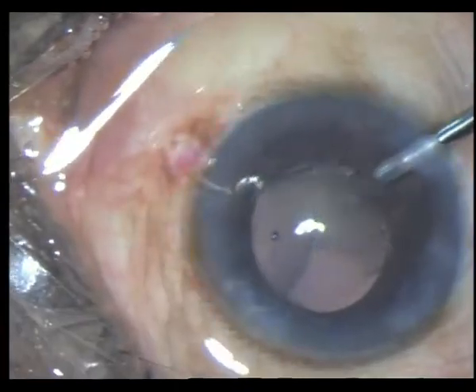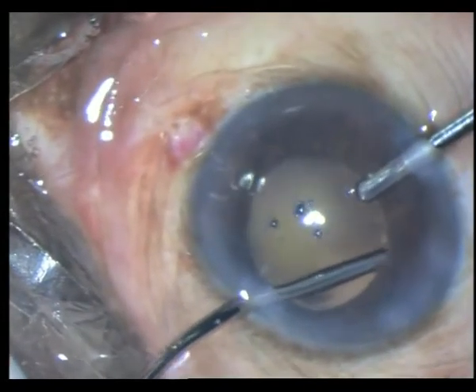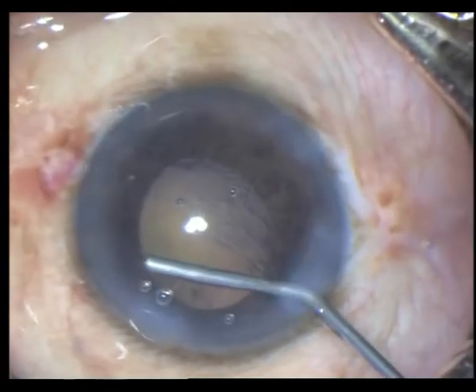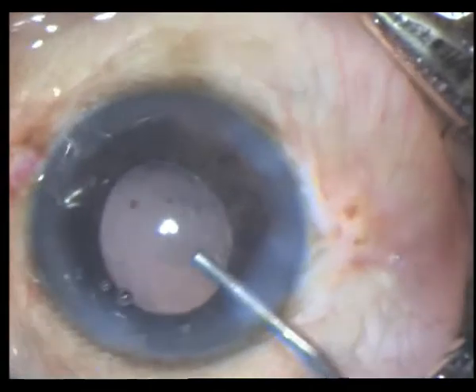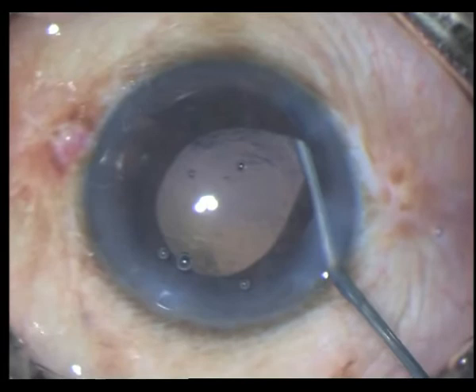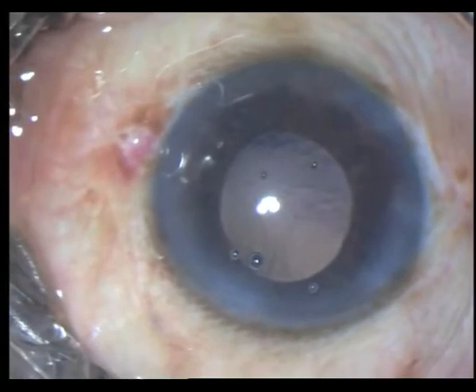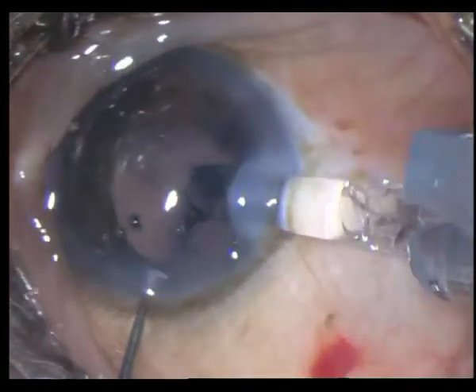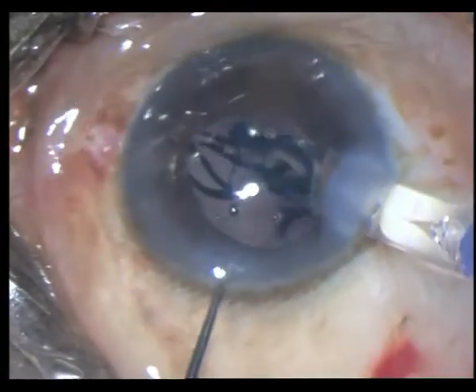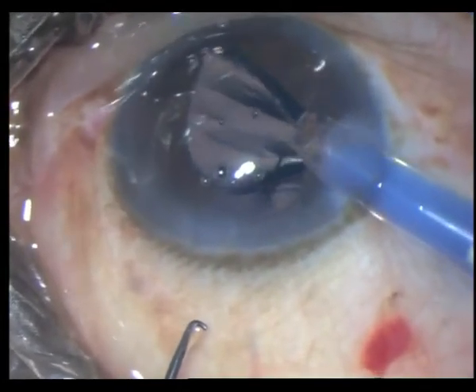Once all the fragments are out, I go ahead and clean up all the cortical fibers. This step is important — since it's a pseudoexfoliation case, I don't like to implant the lens within the bag. So I am creating a space between the posterior surface of the iris and the anterior capsule, and implanting a hydrophilic Rayner model single-piece foldable IOL, making sure that it goes into the sulcus.